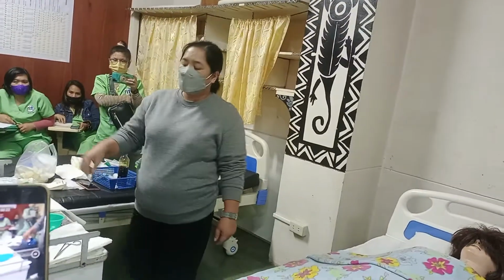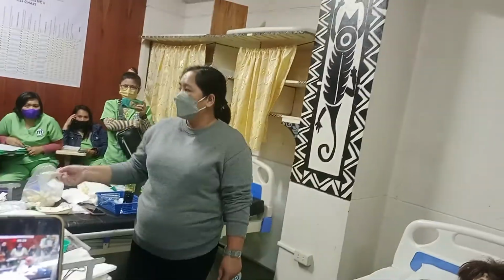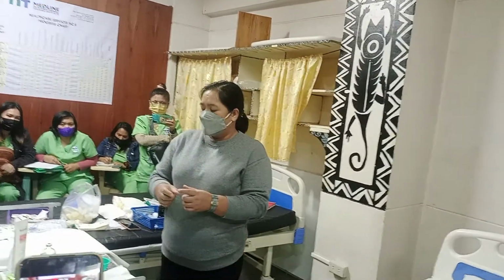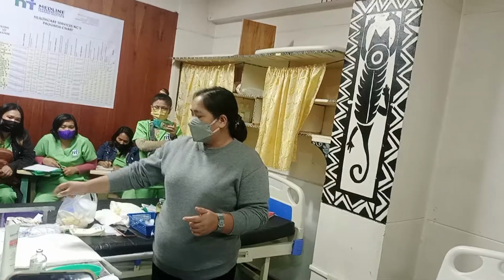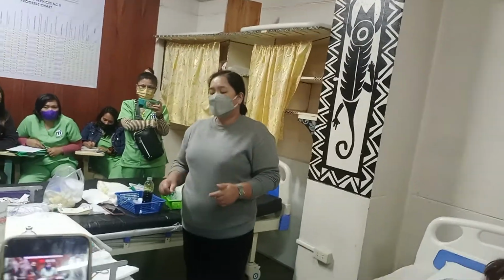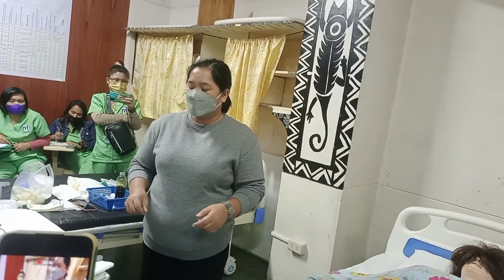So there, I also have here the lubricating jelly. This is used to lubricate, it makes the urinary catheter tip slimy para mas madali siyang pumasok sa urethra ng ating pasyente.